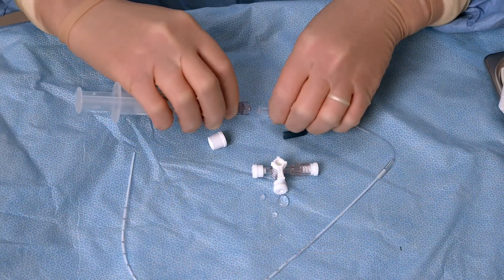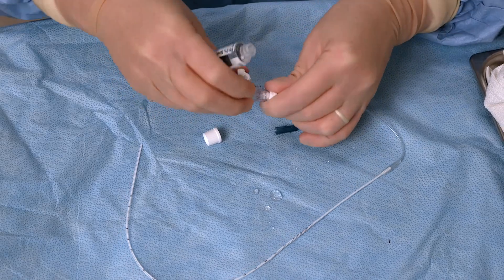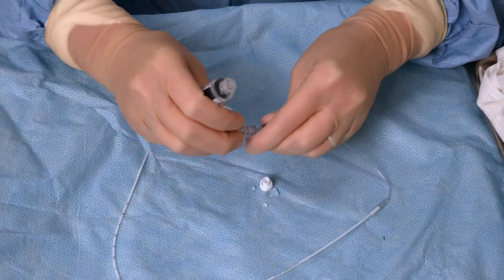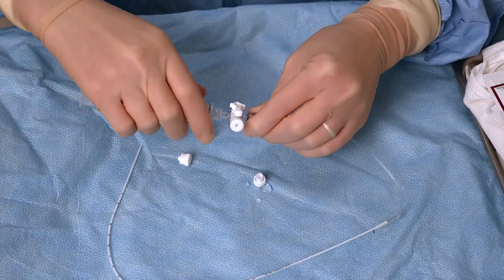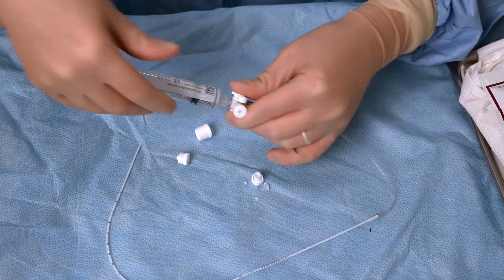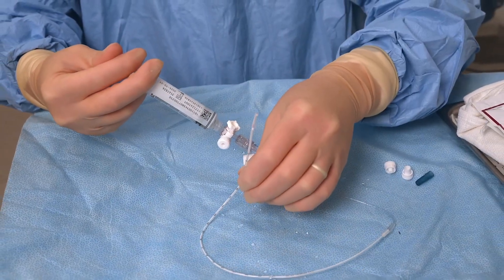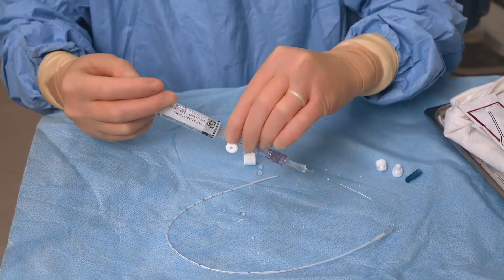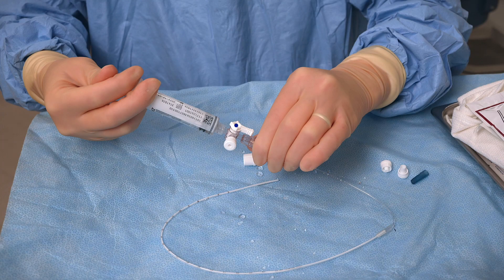Use sterile technique when assembling the supplies. Connect the stopcock to the catheter and flush with normal saline. After the catheter is primed, close the stopcock to the catheter to prevent air from entering or fluid loss. Note which direction is off on the stopcocks used in your facility.